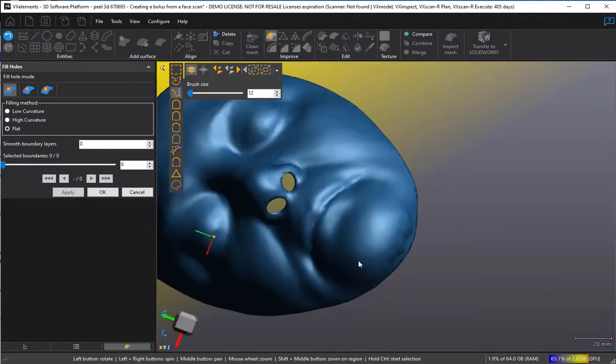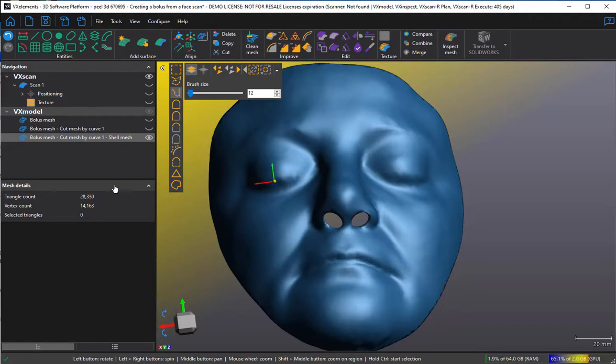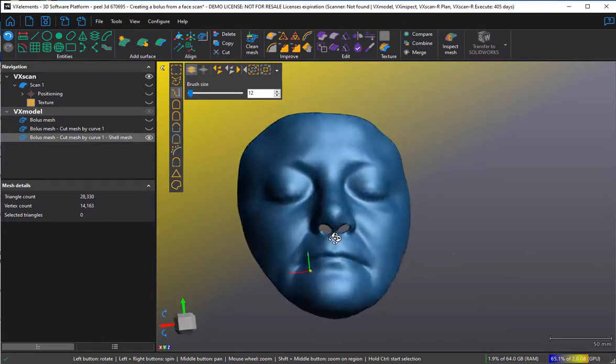So you've got a 3D-printable object. We'll just check that it's waterproof by clicking on it and asking for its properties — and it says it's watertight. A watertight mesh can be printed on any 3D printer. So it's done. You can export these details if you need them, and this file can be sent to a 3D printer to make a perfectly fitting bolus. The whole process didn't take very long. Thank you very much.